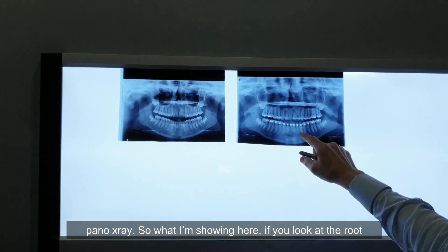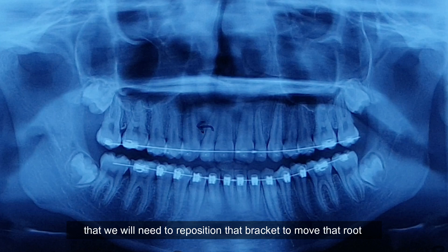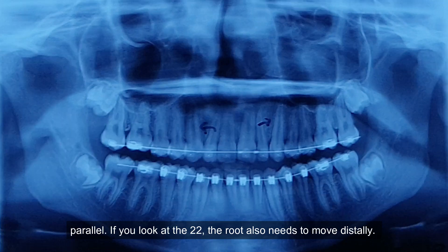So what I'm showing here — if you look at the root of the lateral, tooth number one-two — I will mark on this x-ray that we will need to reposition that bracket to move that root parallel. If you look at the two-two, the root also needs to move distally.